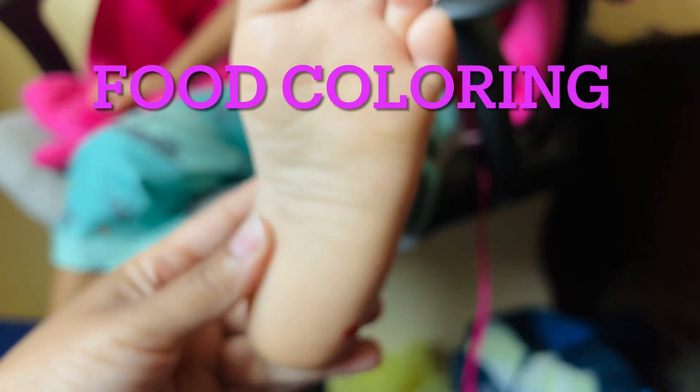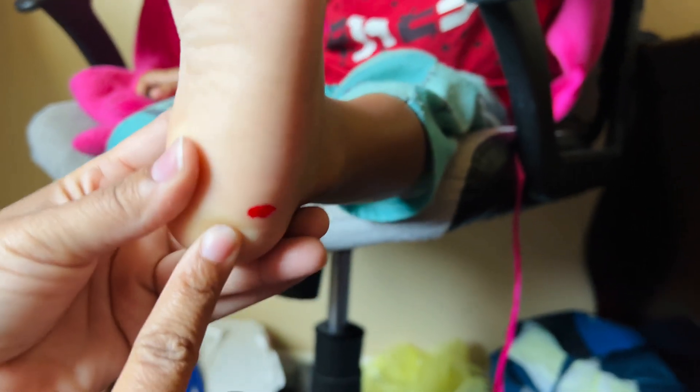For this demonstration I'm not going to be using a real lancet on my son. Normally babies may flinch or cry because the stick can feel a little bit painful. Do not feel scared or stop just because the baby jolted a little bit or started to cry — the procedure won't last long.